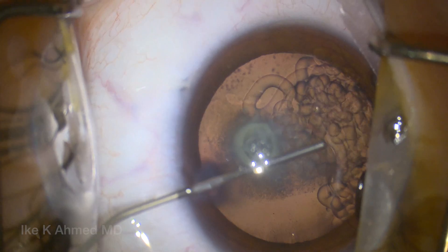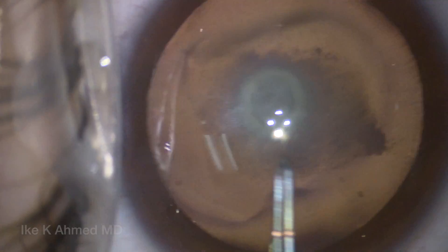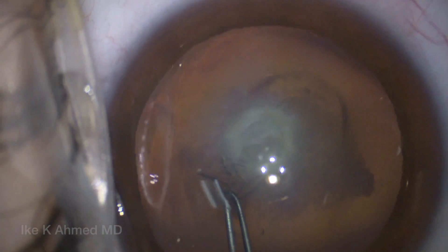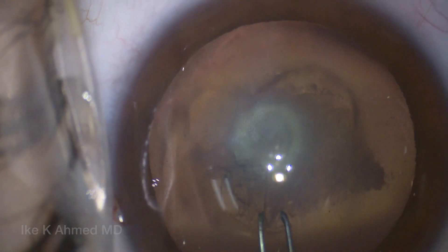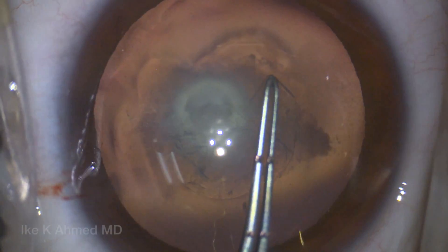Our case starts off routinely with a soft-shell technique using dispersive viscoelastic, along with some cohesive to ensure we have a flat anterior capsule in this young patient. The capsulorexis is initiated with a sharp-tipped capsulorexis forceps, and attention is paid to the elastic capsule, which has somewhat of a tendency to run out, however is well-controlled with a shearing technique primarily here.